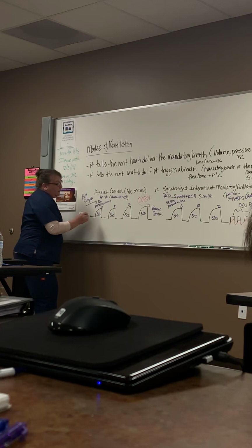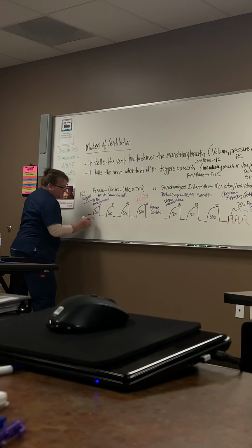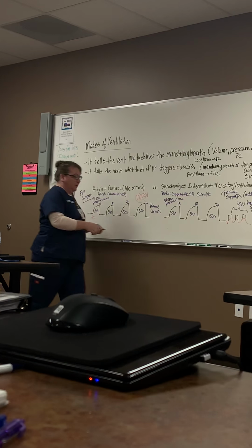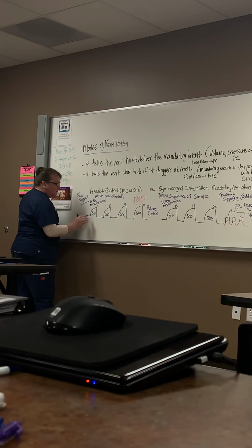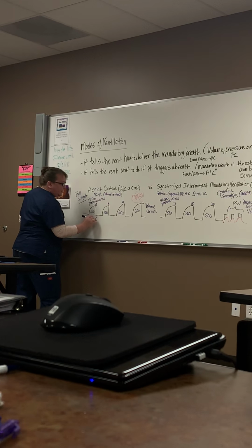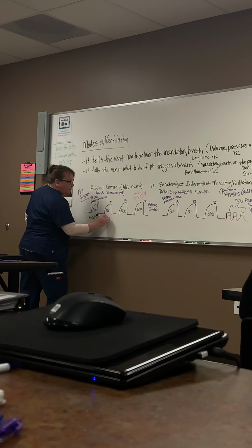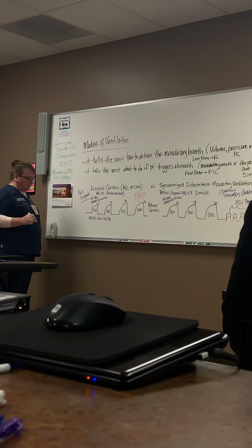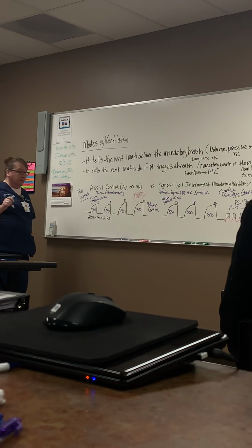So in AC-VC, oh, that's not gonna look good. That's gonna be hard to read. We can set what? Our tidal volume, our respiratory rate. I'm not gonna worry about FiO2 and PEEP because we set that on everything.